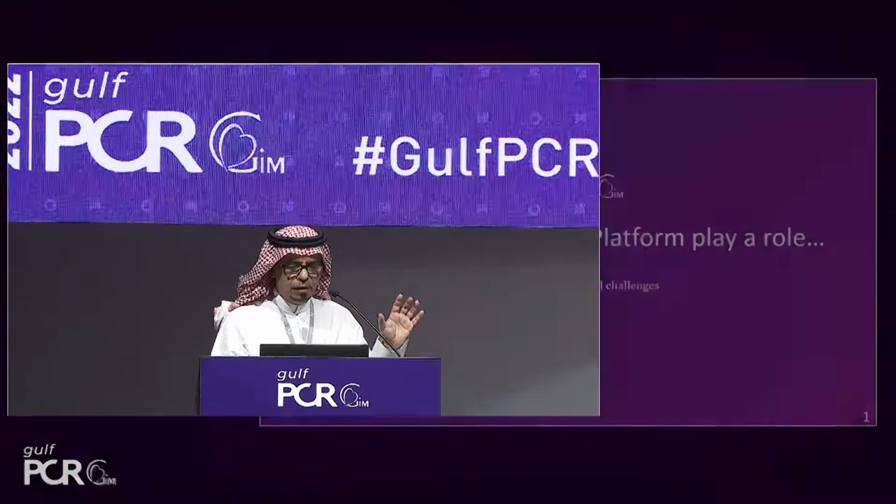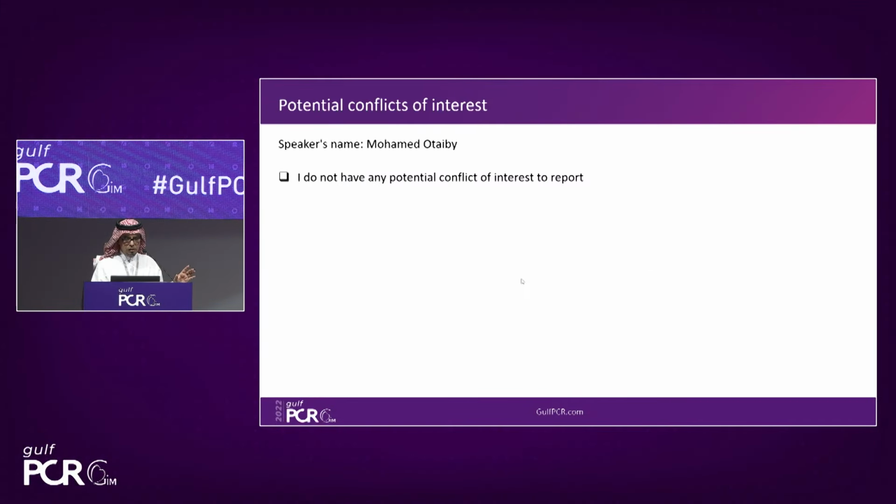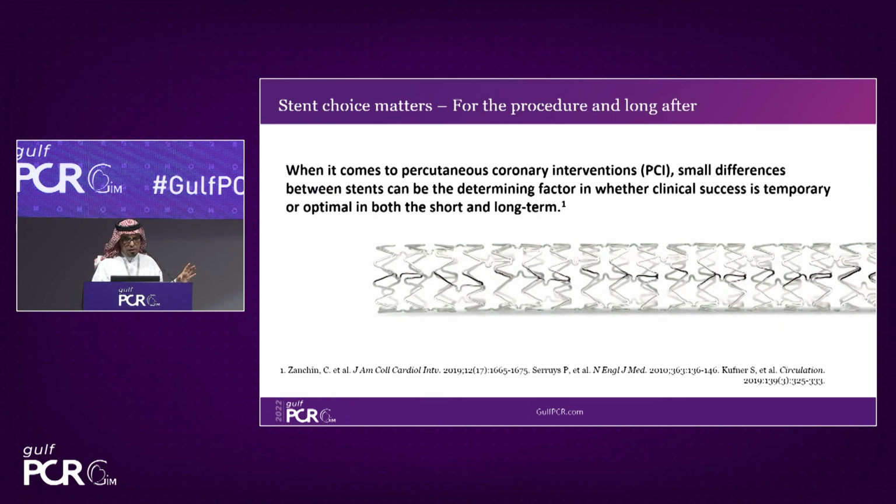Hello, I won't take that long. So this is the title given to me, and I hope at the end of the talk I will convince you why Dr. Khalid and the team of Kuwait use Zion's stent. I have no potential conflict of interest.